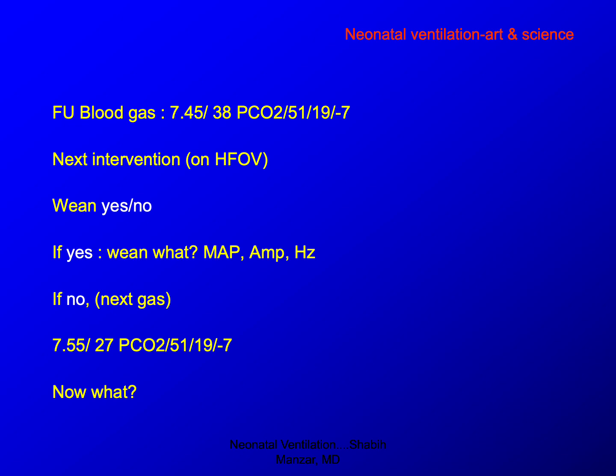by inserting the tube, and look at the gas on the same baby. They said it is improved now. So at this point, again, the question is, should we go back to conventional? Should we continue on high frequency? Again, with an air leak, it's a better idea to try the baby on high frequency ventilation, and especially the jet ventilator. And again, it's a preference, honestly. Like I said, people can debate. But anyway, the gas is further improving here. Actually, now it's more on the alkalotic side.